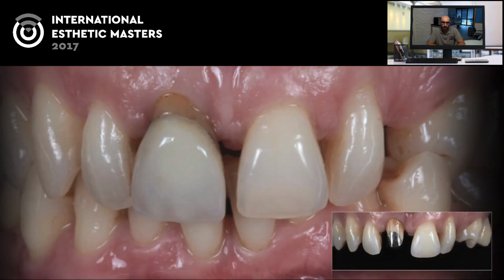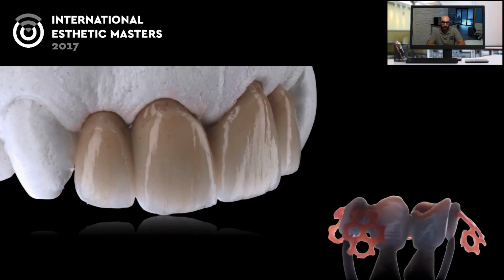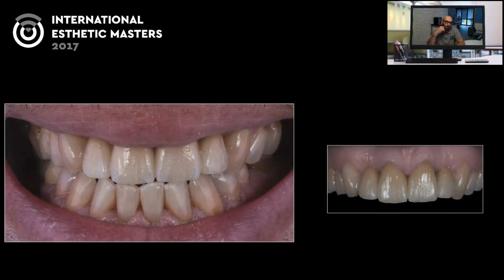Or a case like this, again, with discolored roots and a metal post, and the doctor selects metal ceramic restoration again. Or a case like this where we have only two central preps and the lateral is missing, and the doctor decided on a metal ceramic restoration because we want something very precise on this knife edge prep. The two incisors are made with knife edge prep, and the doctor wants something very, very precise, with a very good fit, and with two extensions on the lateral, and decided on metal ceramic. And yes, with good layering you can have good integration.